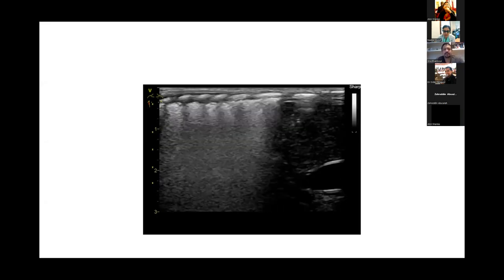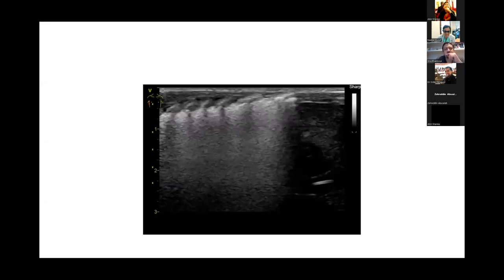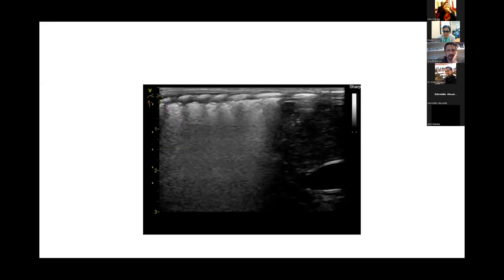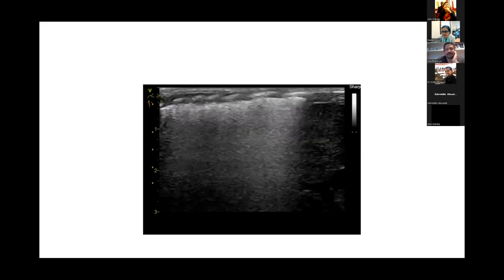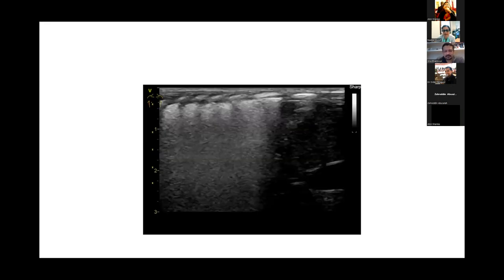And would you describe that as more B profile, right? If I want to score using the Brad score, I could use a score of two. I would use a score of two, definitely. Okay. This is Lichtenstein's B profile, which he uses for hemodynamic edema, but we use for RDS, and it is a score of a two.